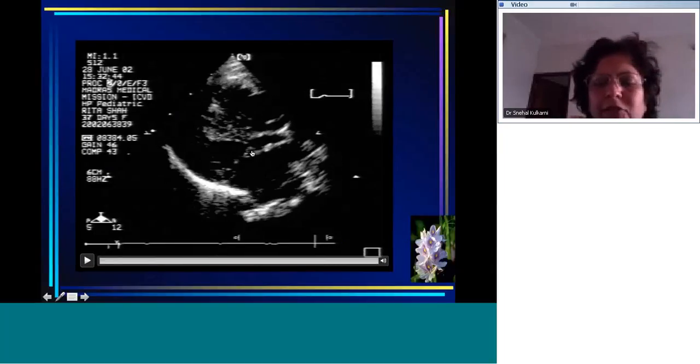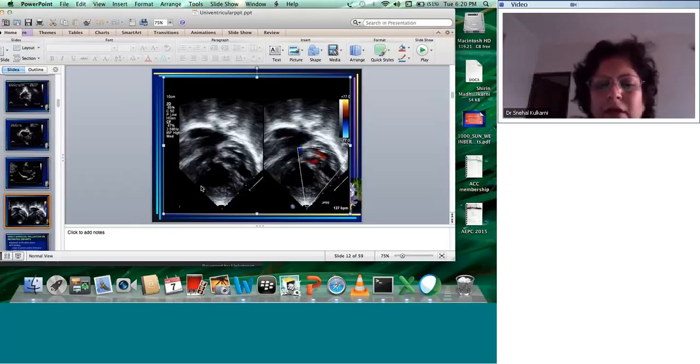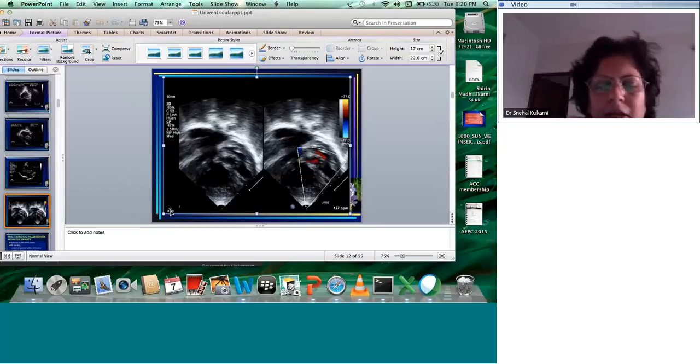Again, in this patient, this is a hypoplastic left heart syndrome. You can see significantly narrow left ventricular outflow tract. So these kinds of patients will have severe LV outflow obstructions, and those need to be addressed immediately after birth. So I don't know whether this works. Okay, this is a patient with actually a double outlet right ventricle and remote VSD, and even if you have 2 good sized ventricles, they are not suitable for a biventricular repair.